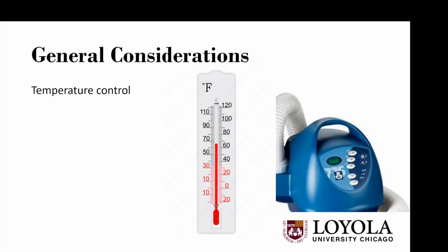Once the patient arrives, we bring it down 1 notch below the highest temperature, which is 43 in our machine setting. Different machines could have different settings.